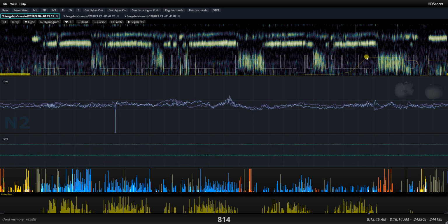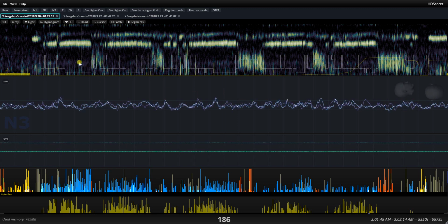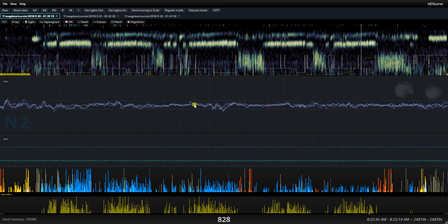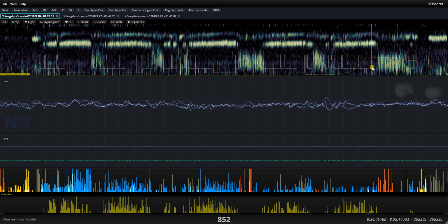But yeah, to be completely sure about this small gap, I go here. This is telling me that it's 3. I verify it against the guaranteed 3. I go back to that. They look very similar. Then I go to a guaranteed 2, which is a little bit earlier. It looks much flatter. So I'm going to say that I trust this. This probably did a correct job.